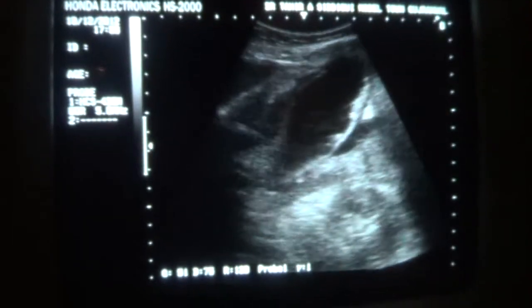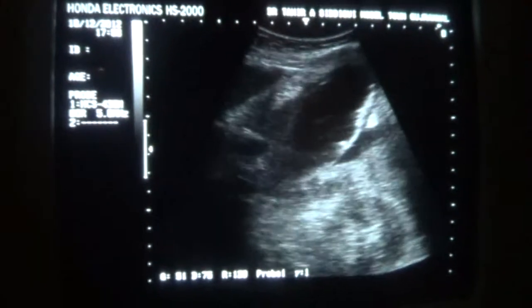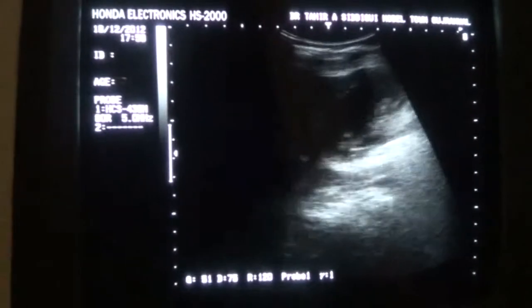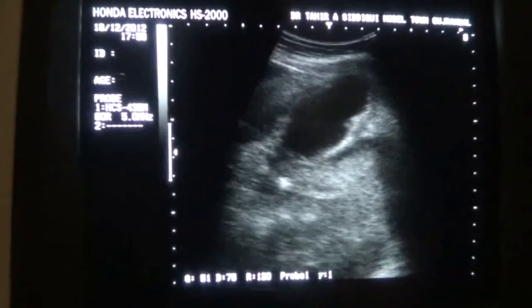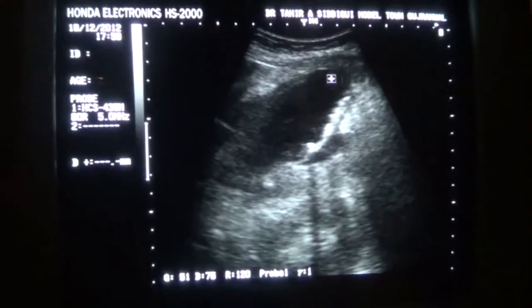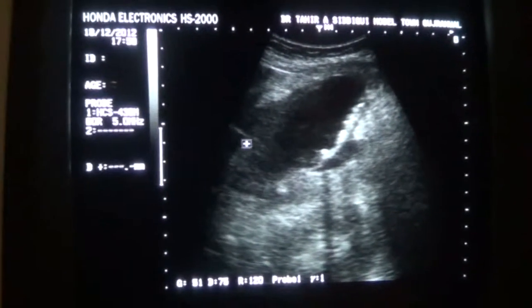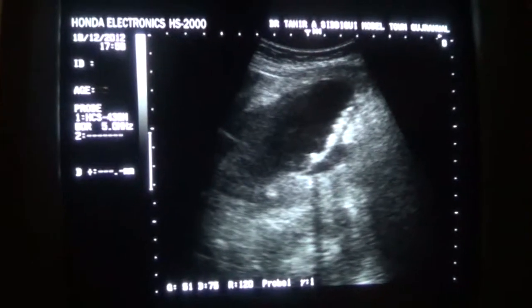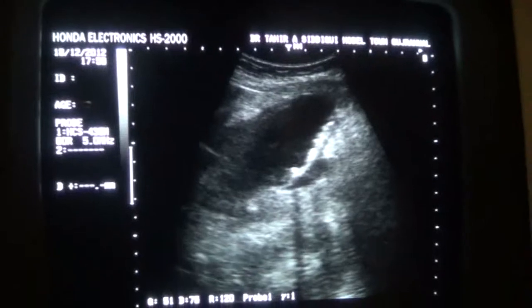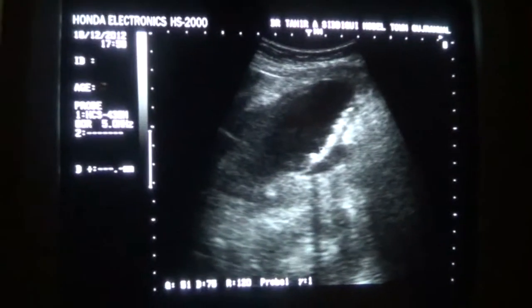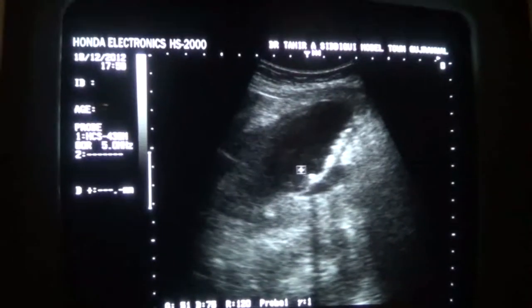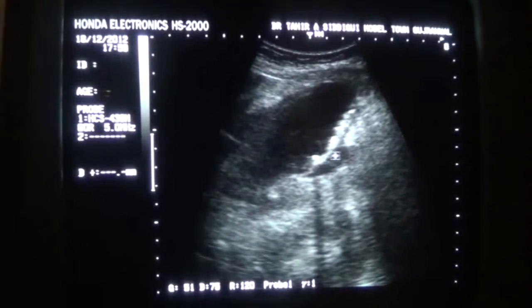This relates to the video study of a case of gallbladder pathology in which you can see that the lumen contains — this is the gallbladder, this is the anterior wall, the posterior wall — and you see a number of calculi, tiny, ranging not more than 2mm, but this one giving a sharp posterior shadow with a small amount of fluid.